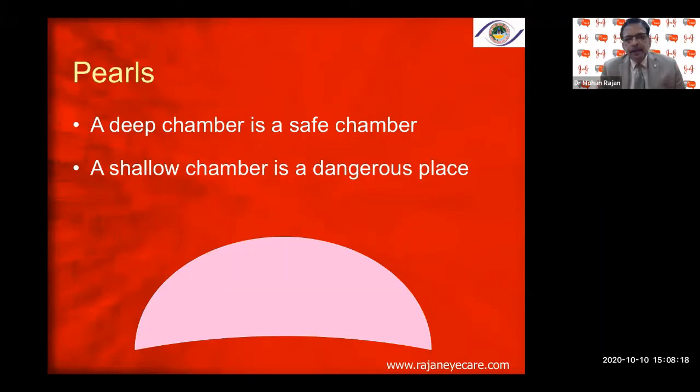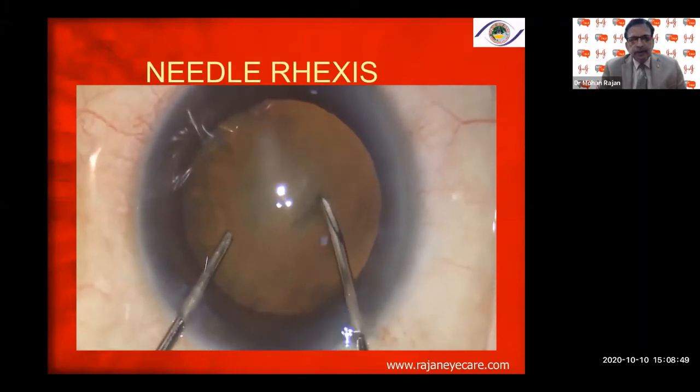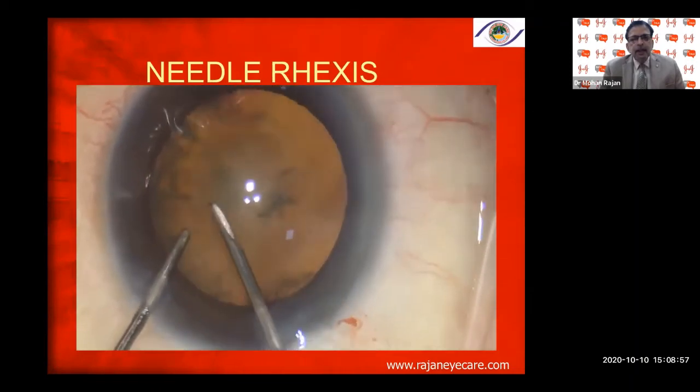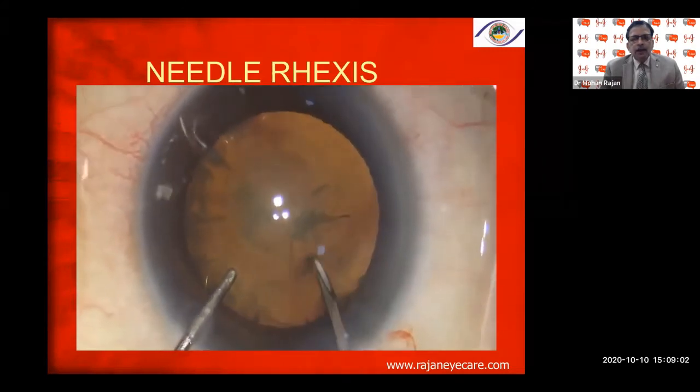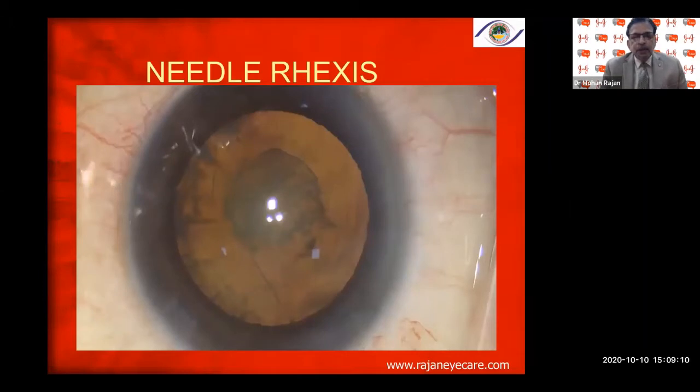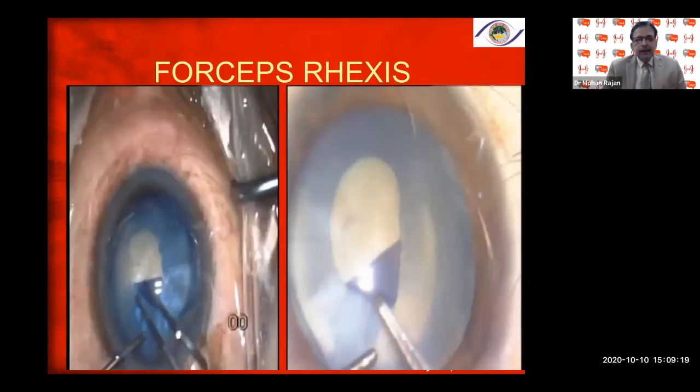A deep chamber is a safe chamber for capsular rhexis. A shallow chamber is very dangerous — if the viscoelastic escapes, the rhexis can go to the periphery, which is one of the most common causes of lost rhexis. You need to come out of the eye now and then to refill the chamber, making sure the anterior chamber remains deep throughout the capsulorhexis procedure until it is complete.